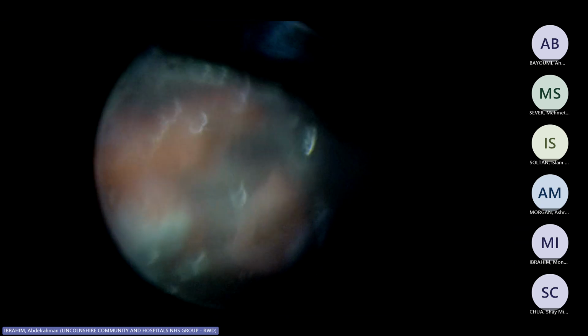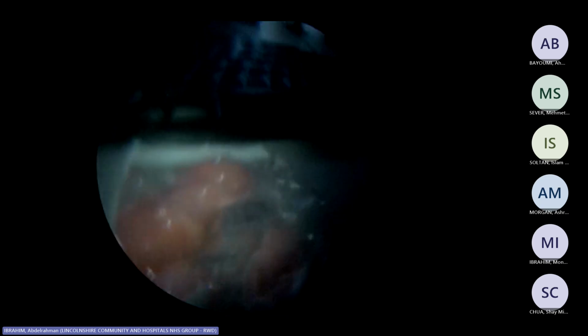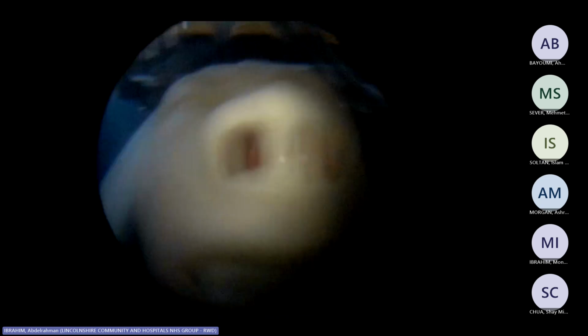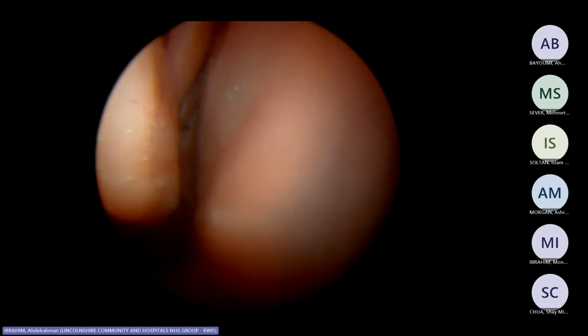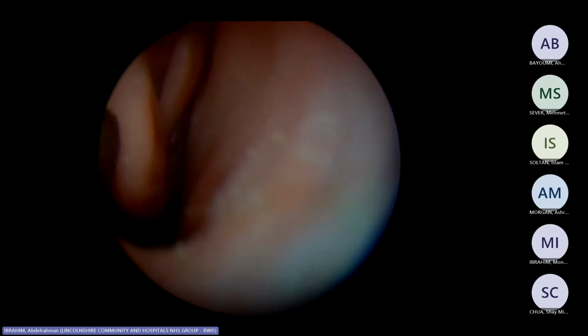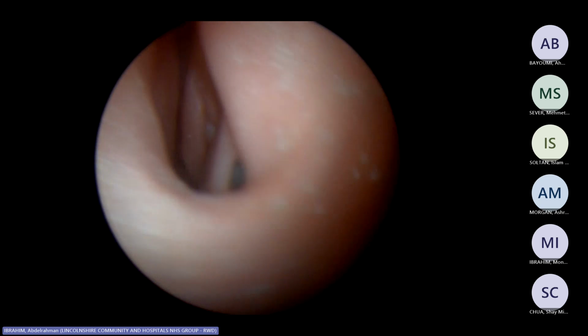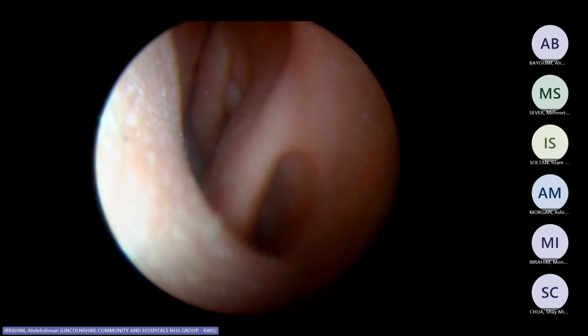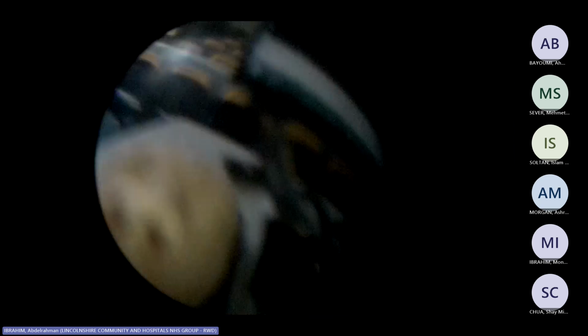Okay, so Mr. Alam is used to using Express, which is what I spoke to you about earlier. With Express, you get this device. When you take it out of the box, it comes bent to go into the frontal sinus, as you can see there. However, if you want to go into the eustachian tube, you've got the eustachian tube dimensions there. So you would just place it into here, and then you would just bend the tip accordingly.